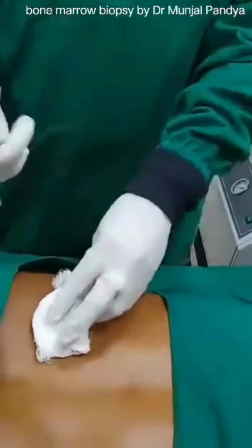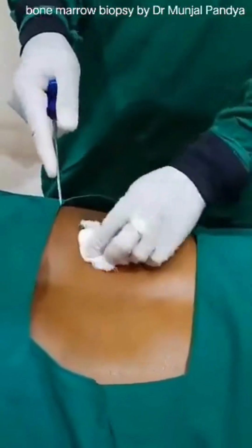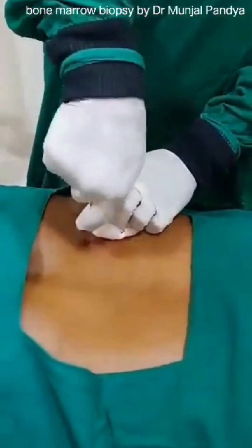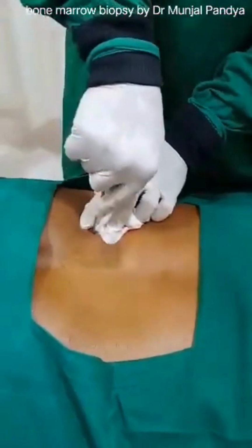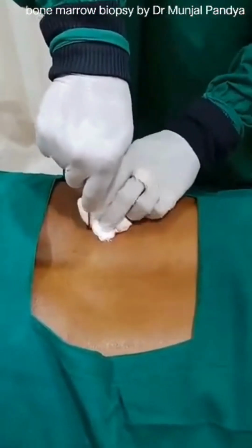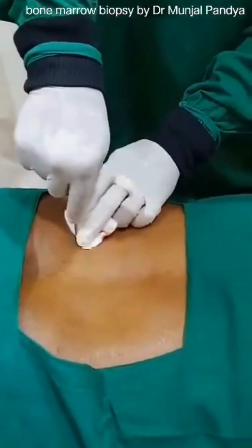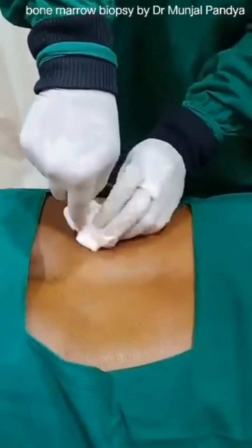So now our procedure for the real biopsy will start. I made a small incision on the skin, and now I am entering the bone in a 90-degree fashion. First I have to locate the posterior superior iliac spine, and I have to ask the patient about pain. If he is saying that he still has pain, I can give more, even 5 cc of local anesthesia.